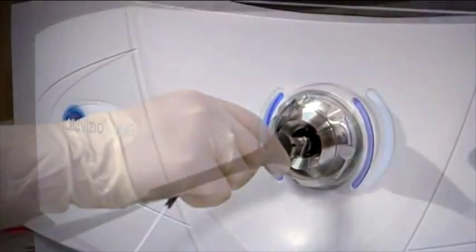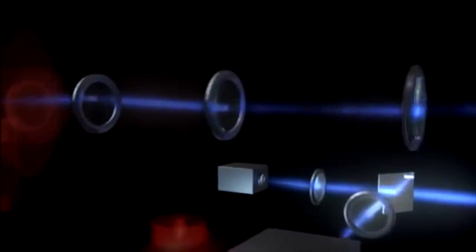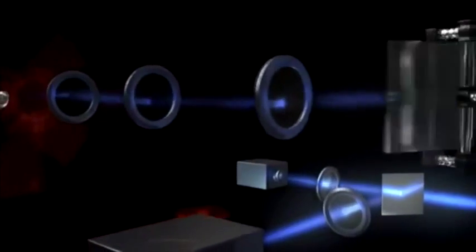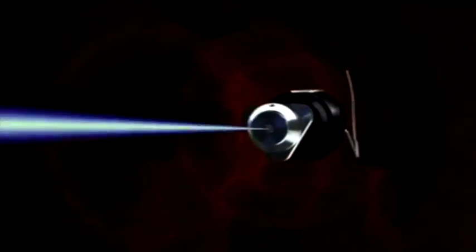At the heart of the Cellvizio system lies a unique patented laser scanning unit, LSU. The LSU integrates a blue laser diode. Its beam travels via a system of lenses and mirrors, thinning it to a micron scale diameter. At the end of its course, the beam is injected into the AlveoFlex mini probe's fibers with unprecedented scanning accuracy and speed.